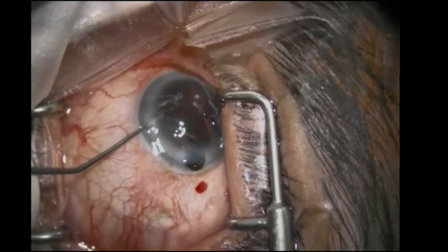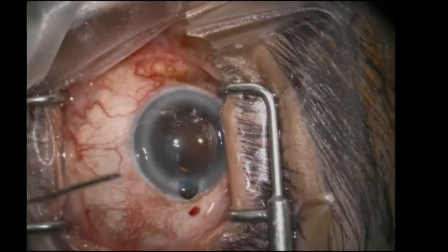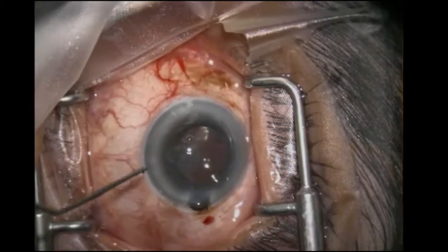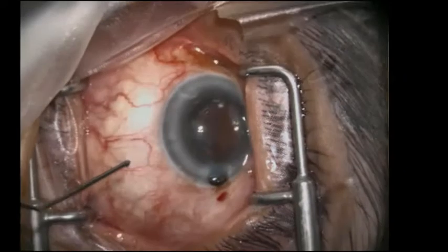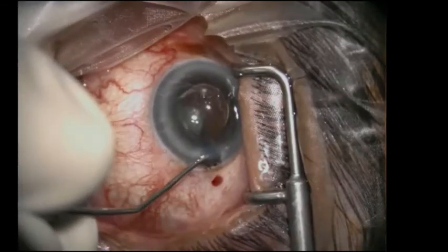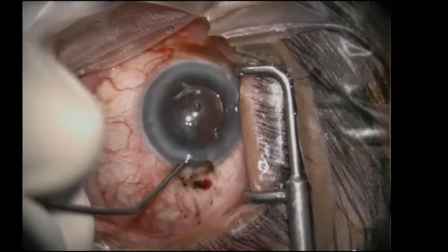The iris repositor was used through the side port entry. The posterior lip was depressed to decrease the raised IOP. The repositioning of the IOL was done simultaneously. The posterior lip was further depressed to help visco extrusion. The iris was reposited back and the posterior lip was simultaneously depressed to allow visco removal and decrease of the IOP.